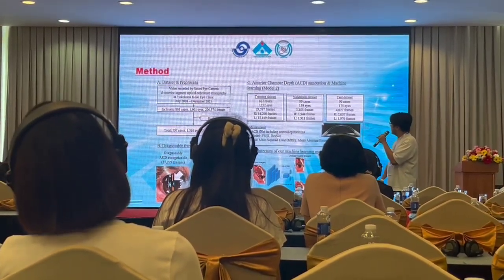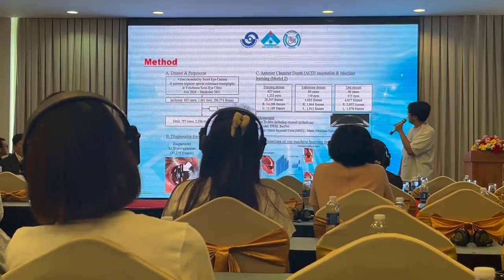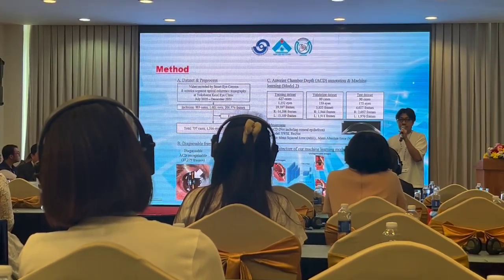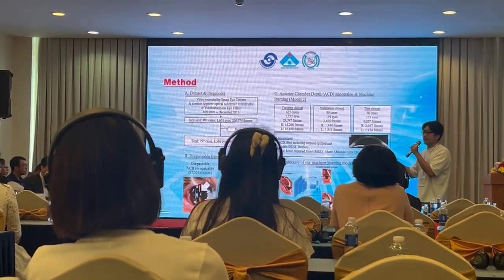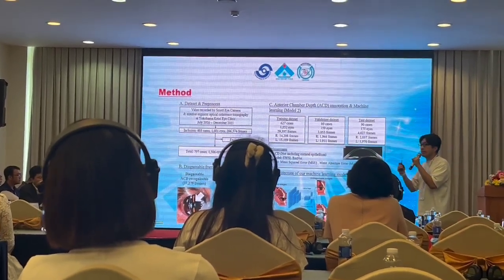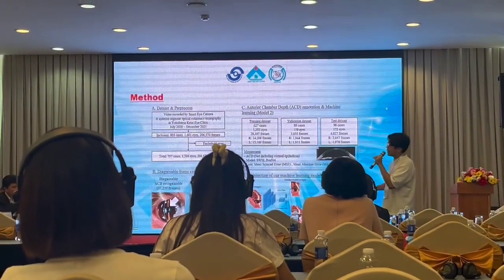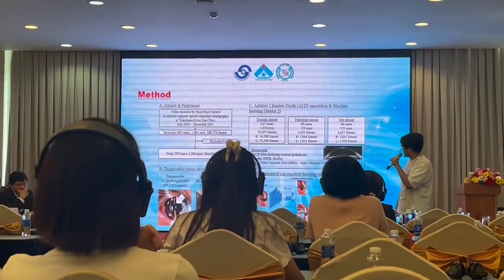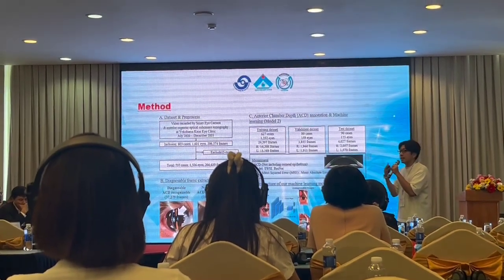Now, in total, 1,586 eyes from 797 individuals. In total, 204,000 frames we gathered. The reason why the frames and the eyes numbers are different is because we take video. So we take anterior segment video from the Smart Eye Camera and slice all of the video into images. So we have over 204,000 frames. Now, of course, not all the frames would visualize the anterior chamber.